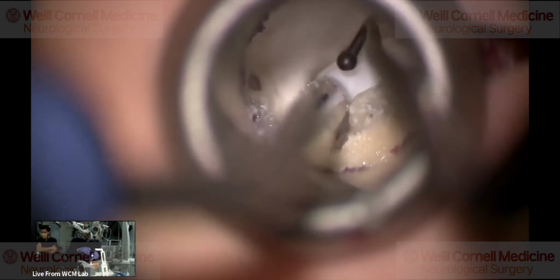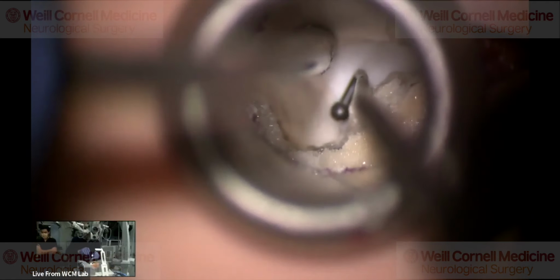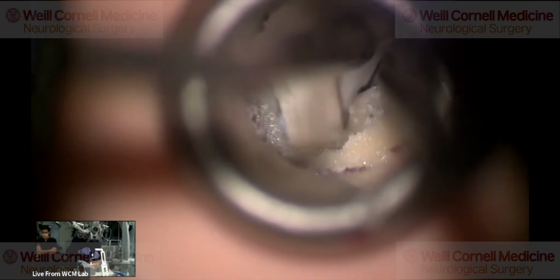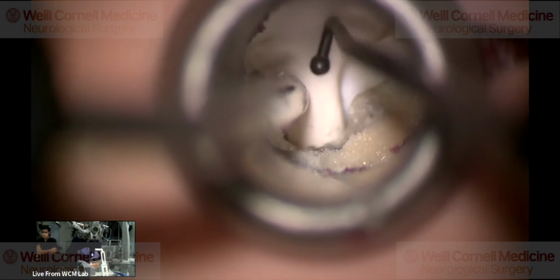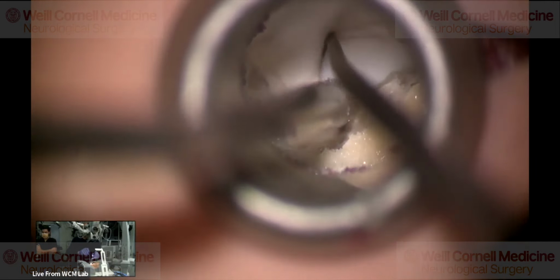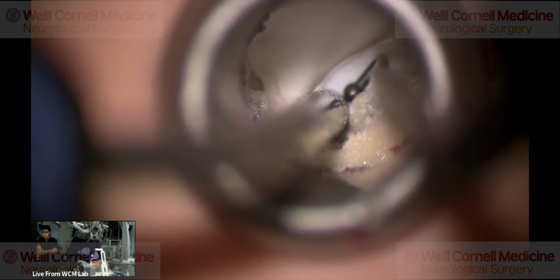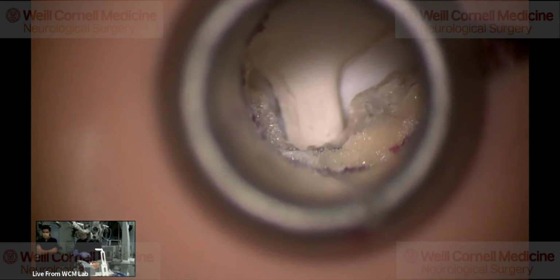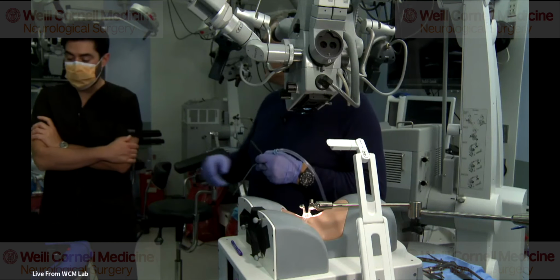and that's what I would remove. Now, when you're looking for a fragment, you have to be careful because sometimes in this model it's one nerve root, but sometimes you actually have two nerve root sleeves coming out, and you can mistake it for a disc fragment. Just imagine you have the same structure like this one, another one underneath, and you can't really see the relationship to the thecal sac. Then you can get confused, and you may think that that's the disc herniation, but it's actually the anterior nerve root. There's sometimes the posterior and then the anterior nerve root sleeve.